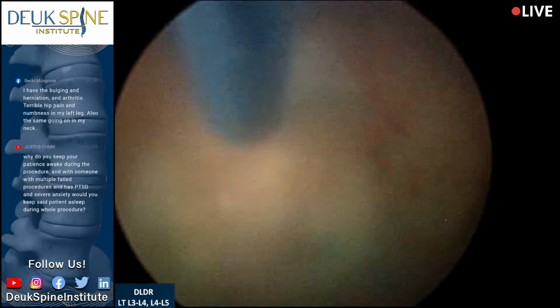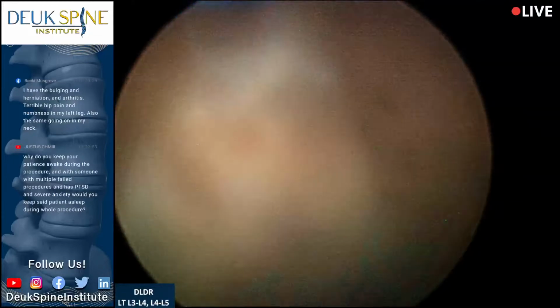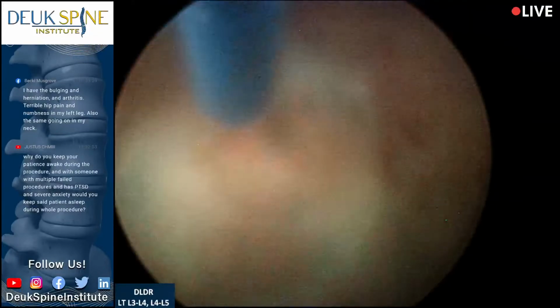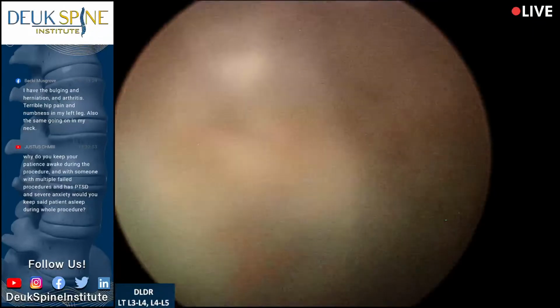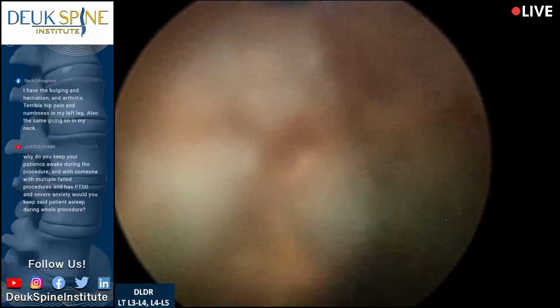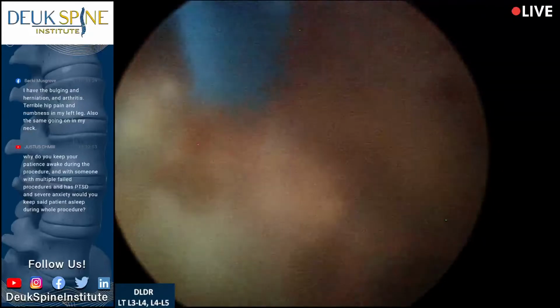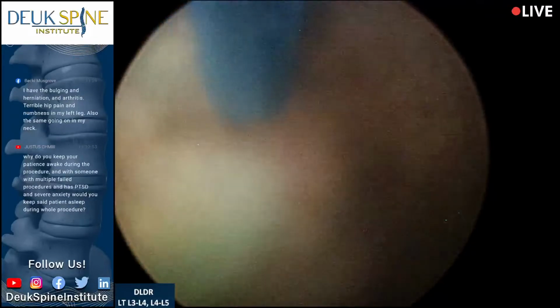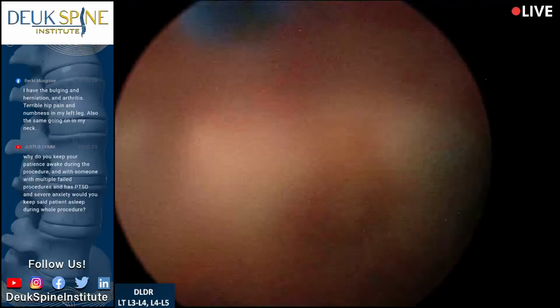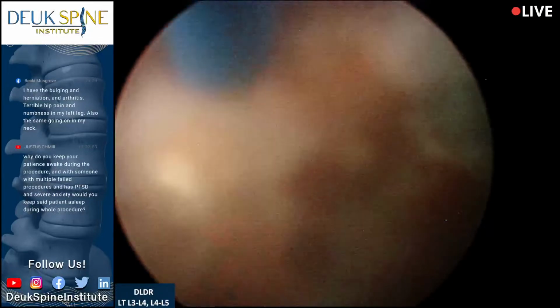Yeah, great question, Justice. So the answer is our patients really aren't awake, okay? They are sedated, but the amount of sedation they have on board fluctuates throughout the surgery, and that's normal. It happens in every non-general anesthesia case, and this is a non-general anesthesia case.